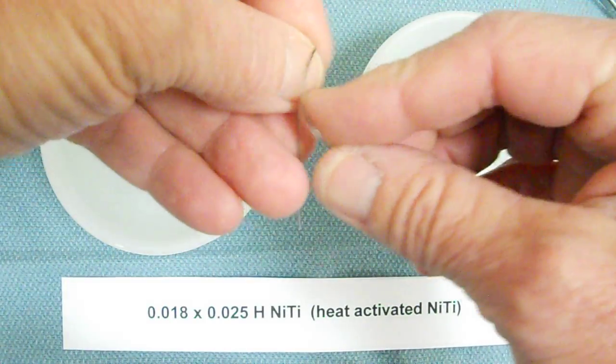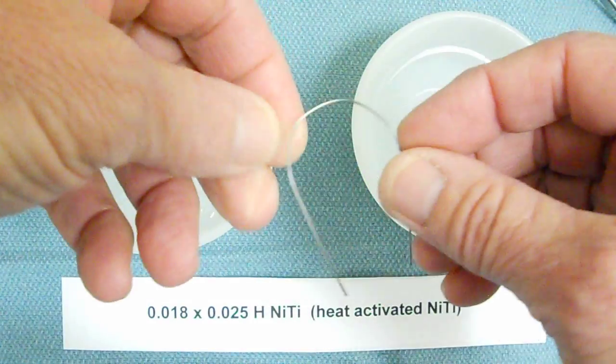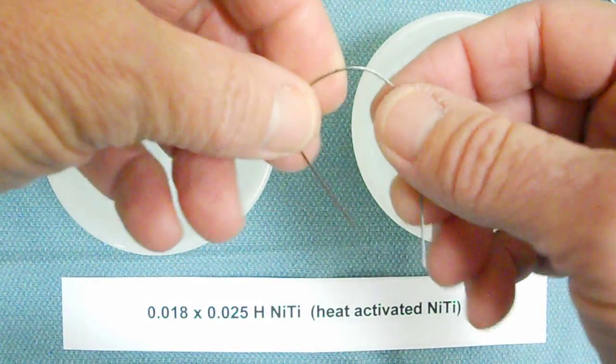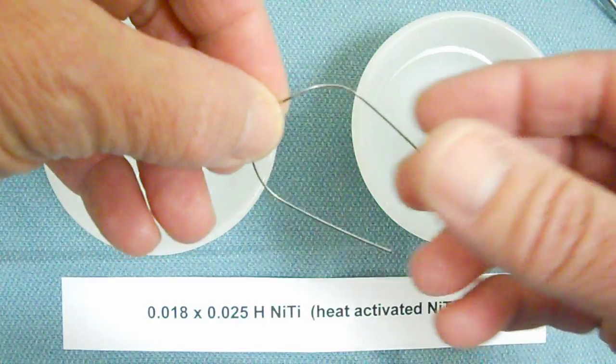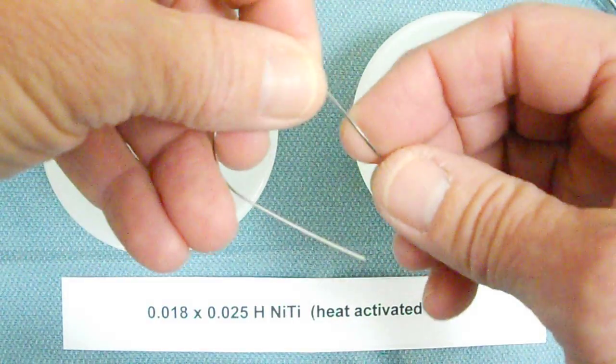When you take it out of the package, it feels kind of like a dead soft wire in that you can bend it, which is different than the NiTi that we just looked at in the round NiTi versions.